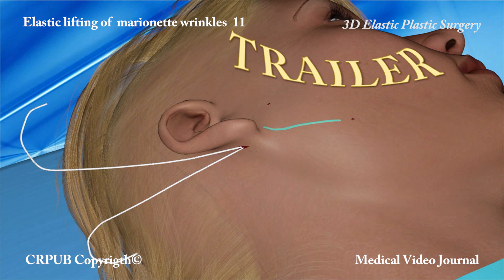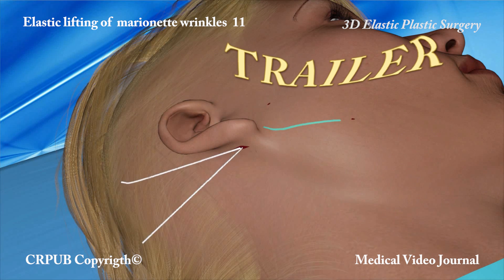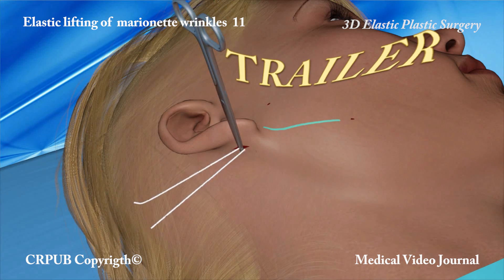The elastic threads are knotted and the small incision is sutured. The operation is complete.